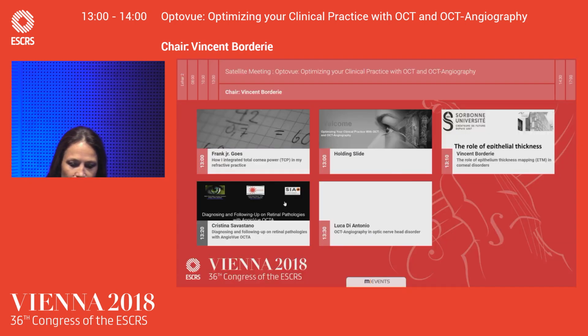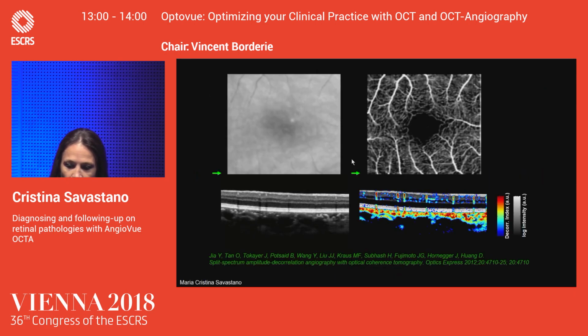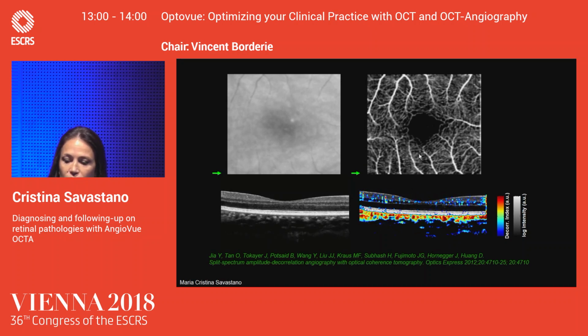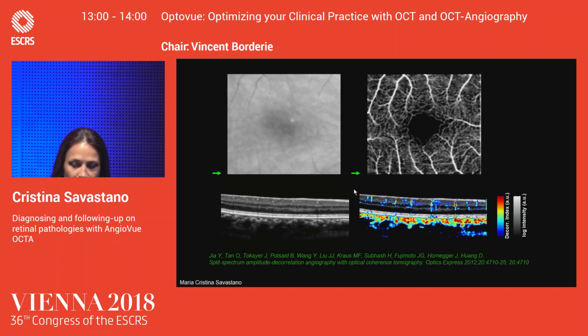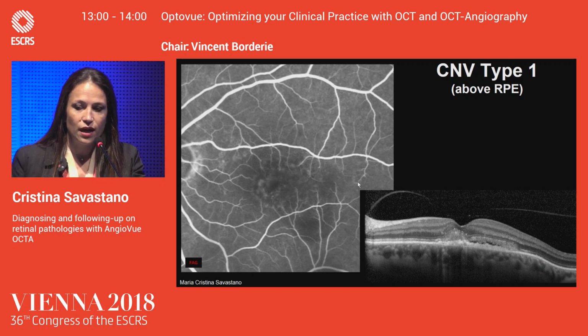And my talk is about diagnosis and following up on retinal pathologies with AngioVue, OCT angiography. And recently, we appreciate the analysis of retinal vascular into the retina without dye injection associated to the analysis of the retinal structure by the use of OCT angiography. The most important application is in wet AMD.